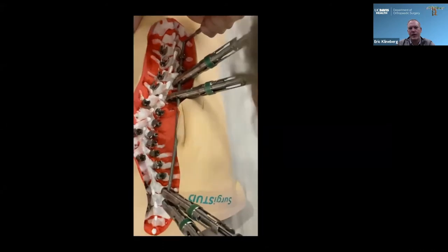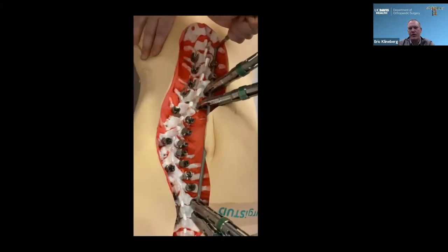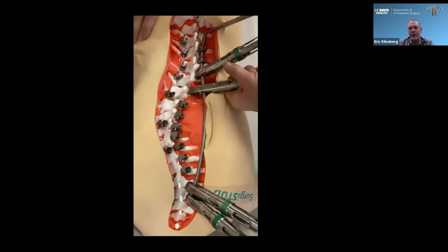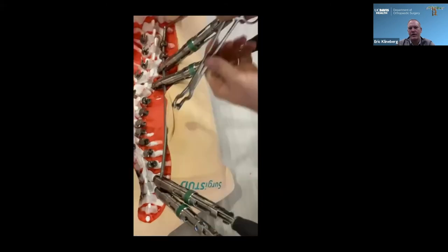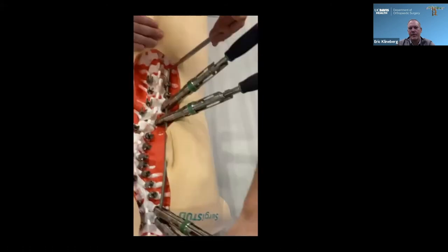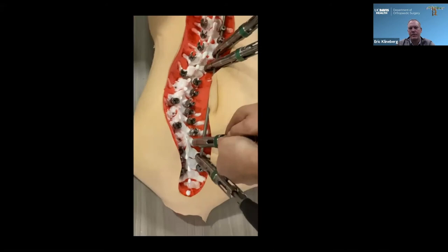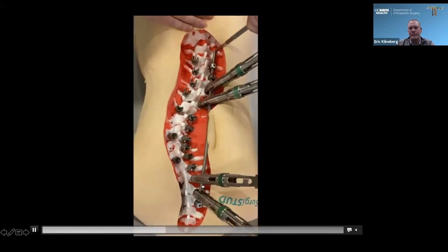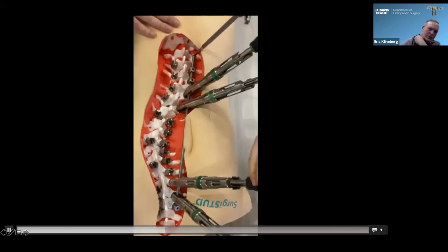Get things locked in place. And we kind of work towards the apex. Again, whichever ones look like they're gonna help us. And if you notice, we always have two on each side that are helping drive things and hold things together. Now we're gonna work to the top. Bring a clip in. Driving that rod down.